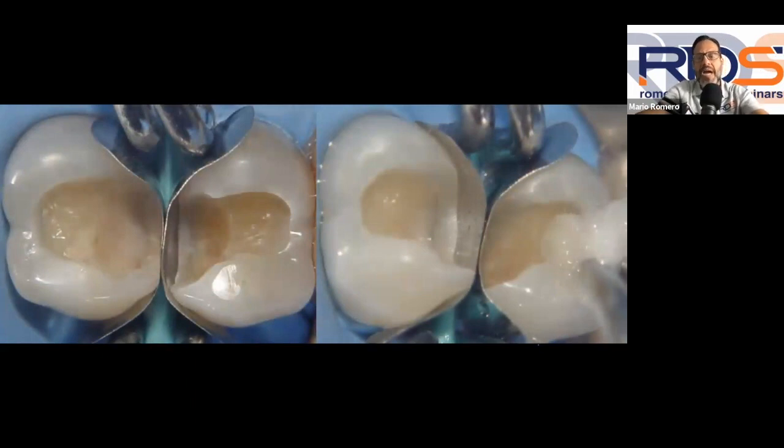Number one, you have to have a good sectional matrix system. Now, there's a lot of good systems out there. This system that I'm using, this is an old case of mine. This system that I'm using here is the old version of the Garrison ring, which I still love. I think that this is something you must have in your practice. I do believe that there's a lot of different systems today that have wider beaks that are very, very useful from a clinical standpoint. But I have encountered multiple clinical situations where none of those systems actually work.